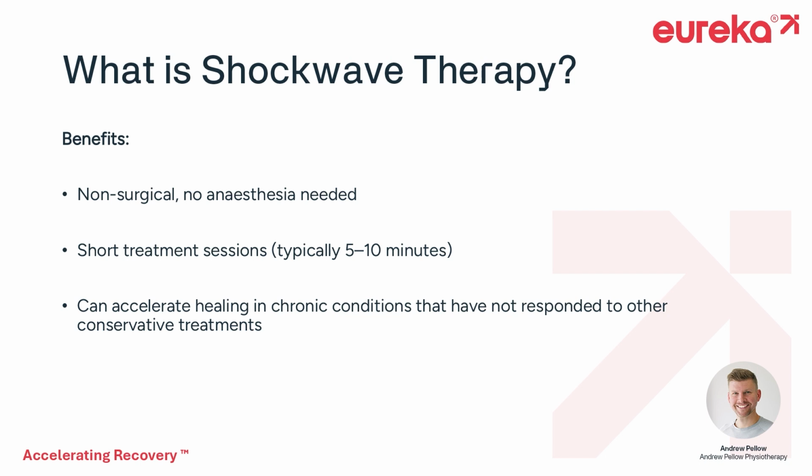The treatment has been shown to accelerate healing in chronic conditions that haven't responded to other conservative treatments, and its use has been approved in a variety of conditions by the National Institute for Health and Care Excellence, with NICE guidance allowing routine use in plantar heel pain dating back to 2009.